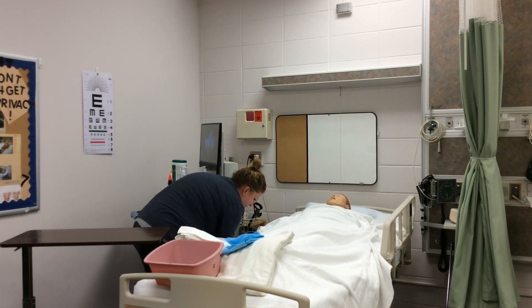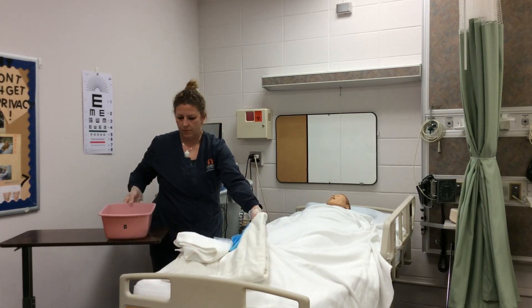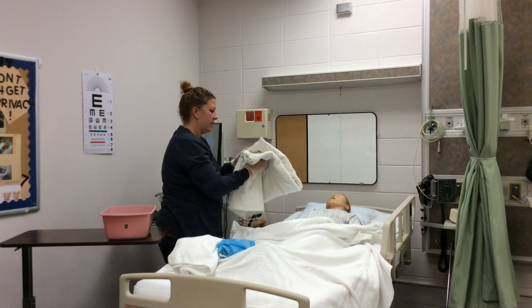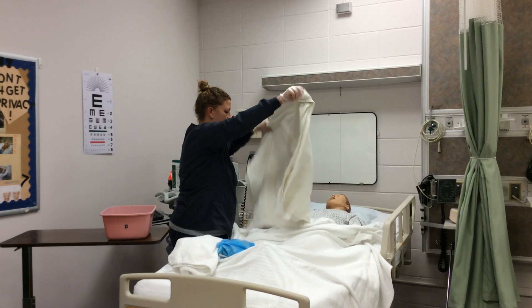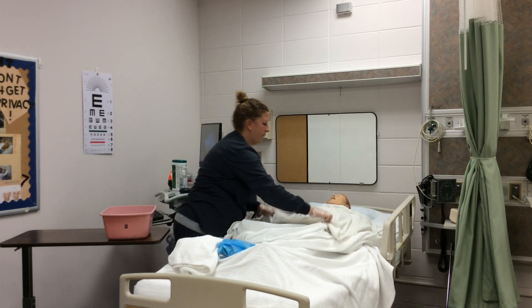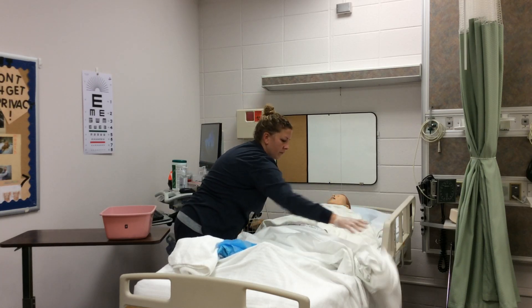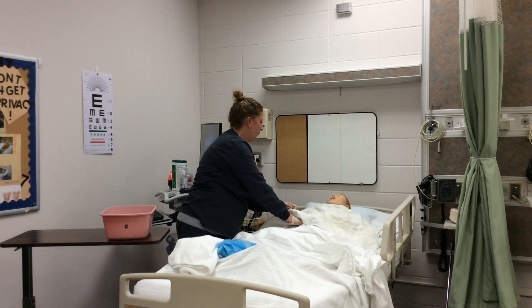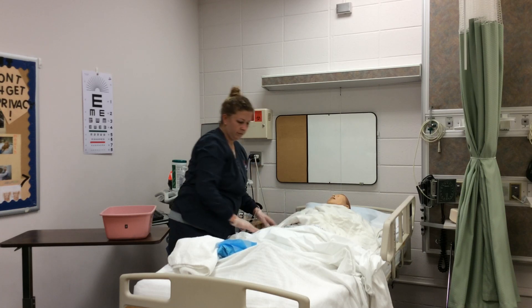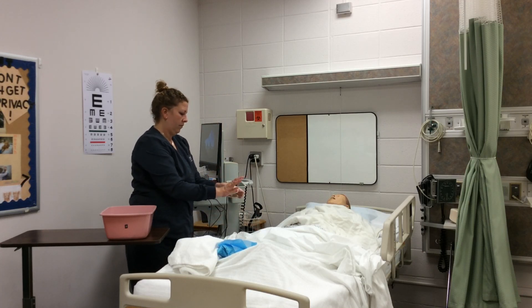She assesses for bladder distension by palpating the bladder or using a bladder scanner if ordered. She pulls the blankets down and places a warm blanket over the patient's shoulders. Upon palpating the bladder, she notes it feels very full. She then removes her gloves, performs hand hygiene, and applies clean gloves.